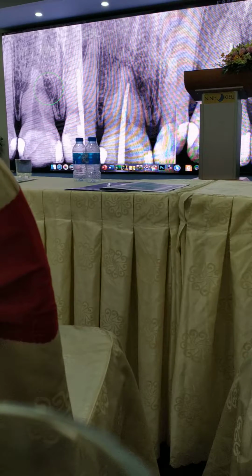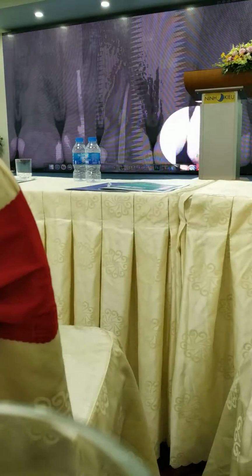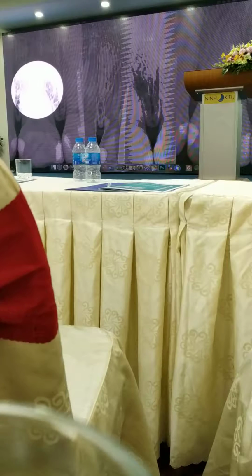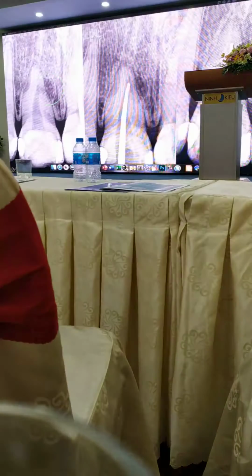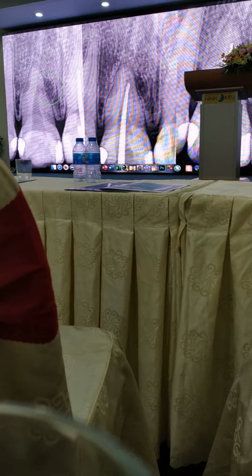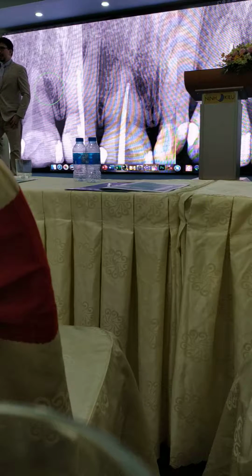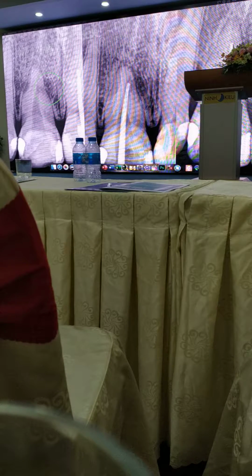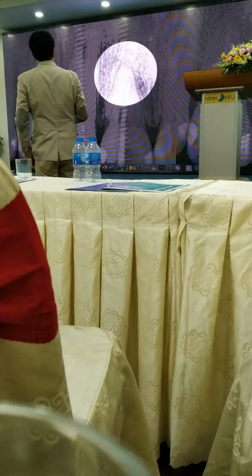I have this case with this lateral area. I was a little bit suspicious about resorption or a big lateral canal in that area. And when I was working, I wasn't able to get inside the main canal.